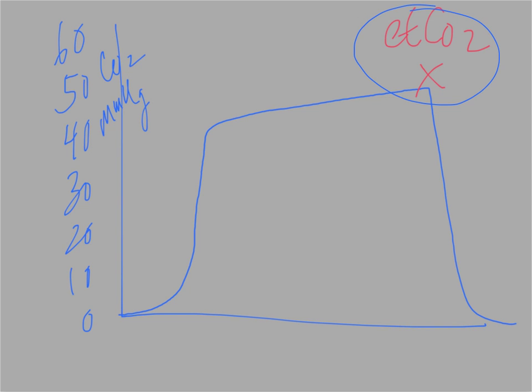So when we have end exhalation, we can think of that as the carbon dioxide coming from the deepest part of the lungs possible that can be expelled through all of the dead space areas such as the trachea and the upper part of the lungs really. And what we get then is that measurement of end tidal CO2.